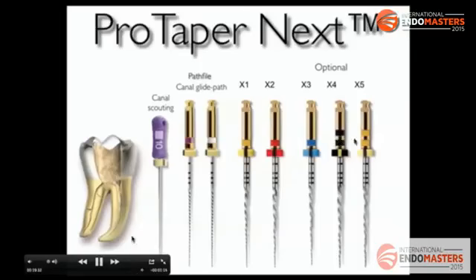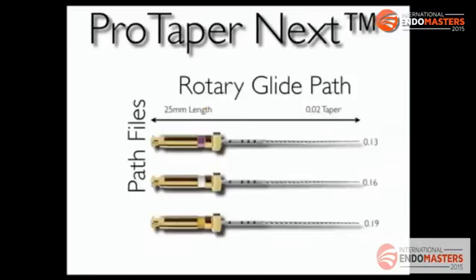We have to try first with a 10 manual file to scout the canal. Then we use 2 path files, the 13 and the 16, to make a glide path in the canal, and then we start working with the X1, then the X2. If we need something more, maybe X3, and only sometimes X4 and X5. We have the path files. This instrument is a great instrument.